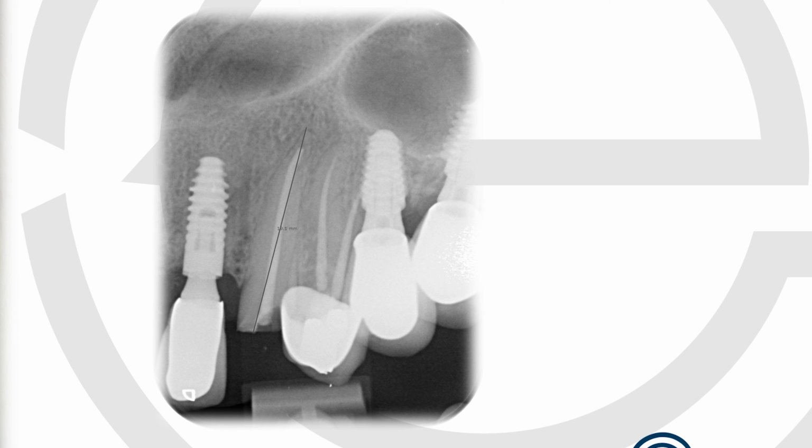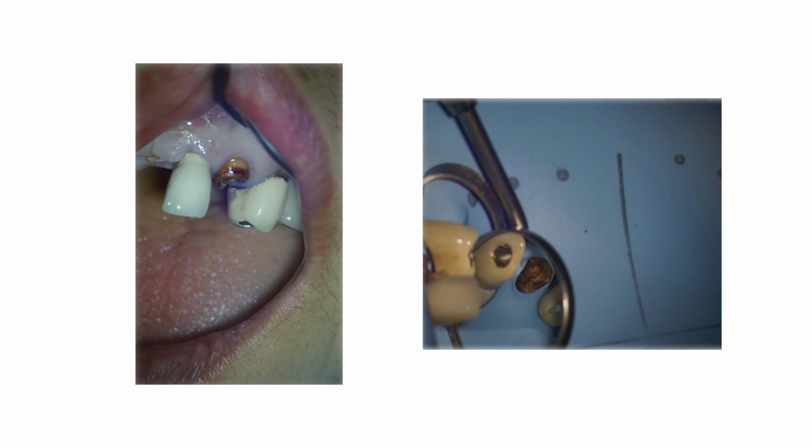If we look at the alveolar crest, there is a lot of root supporting the final restoration. So the crown to root ratios here are favorable. And then finally, looking at biomechanical evaluation, because we've talked about aesthetics. Biomechanically, we talked about the ferrule, or the ferrule effect. Ideally, you should have 1.5 to 2 millimeters of tooth all the way around the tooth.